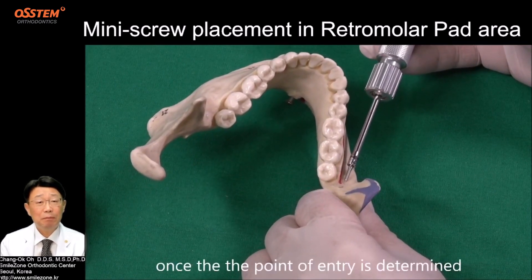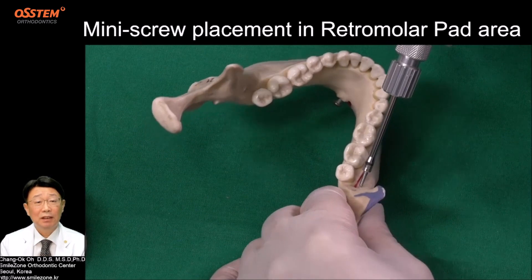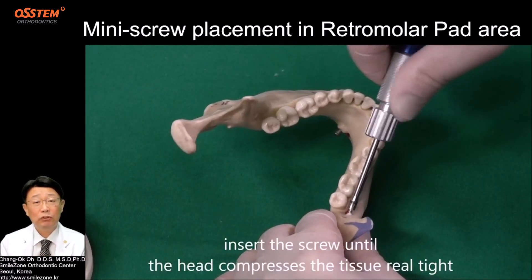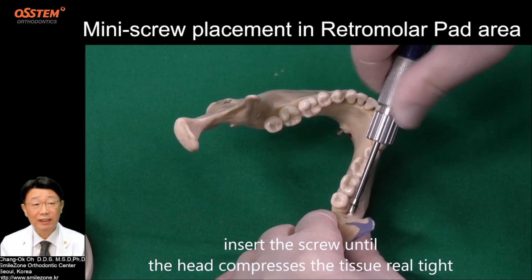Once the point of entry is determined, insert the screw until the head compresses the tissue real tight.